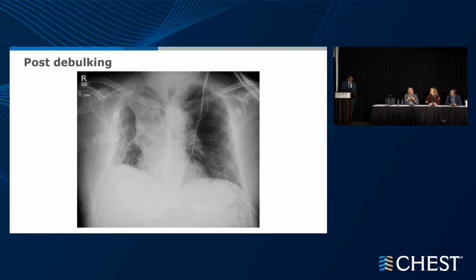But here, if I know the histology, that will help a lot. Yes. Because if this is small cell, big difference. This is perfect, what you've done. Start your treatment, it's going to melt in a few weeks, initially. If it's lymphoma, deja vu all over again. If it's a non-small cell, which smells like it because of the progression that you showed on your scans, then in this day and age, I would probably stent that.